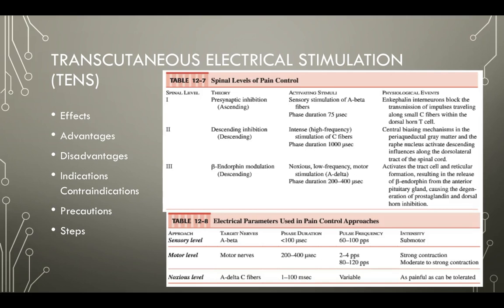Then when we do the post-treatment, right, we turn off the machine, we remove and put the pads away, we check the area for any redness or burns or any other sort of irritation, do our pain scale or our patient-oriented outcome again to document that, give any instructions, start them on their next exercise or their next treatment, give them home and self treatment instructions, schedule their next treatment, tell them their level of participation, and then document all of that.